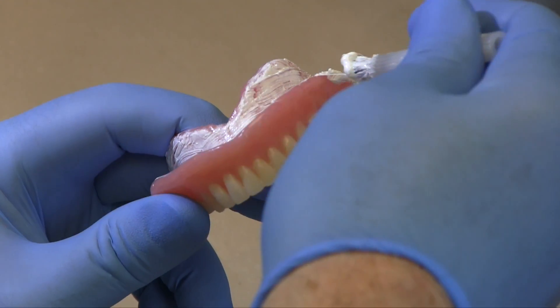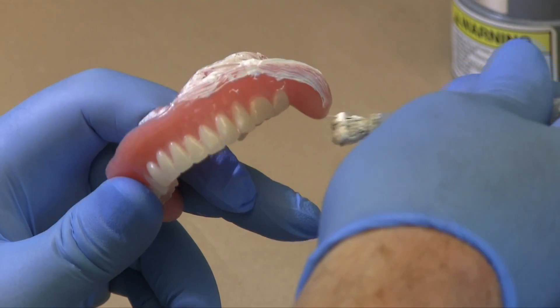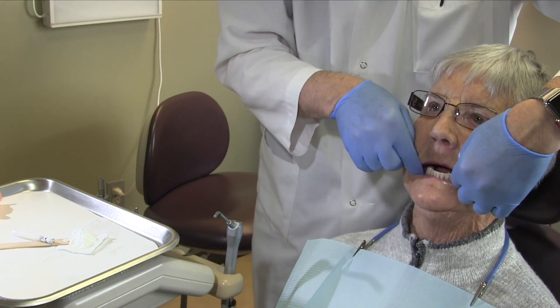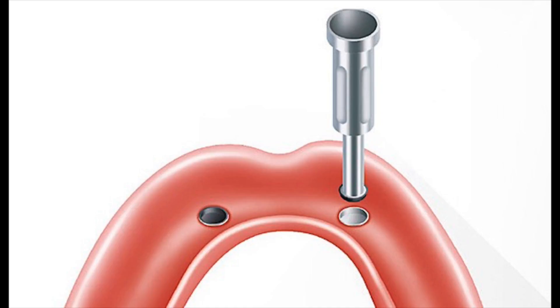Prior to placing retentive inserts in the overdenture, adjust the implant overdenture to ensure there are no anatomical impediments to full seating of the prosthesis. Once that's done, place retentive inserts in the attachment housings and attempt to seat the prosthesis intraorally. If the denture does not fully seat, proceed to the next step.